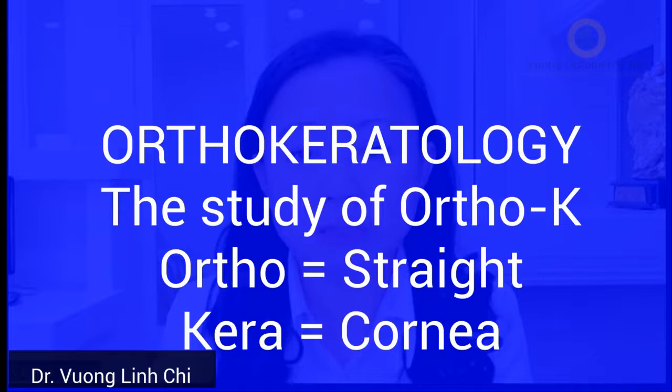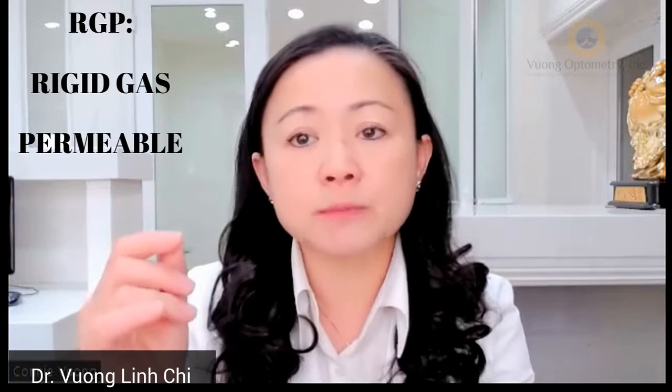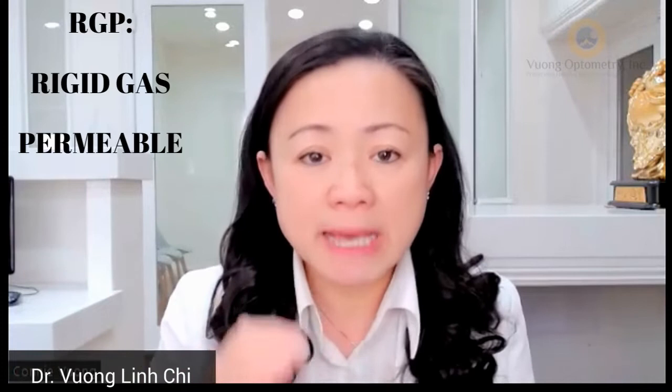Let's talk about what is ortho-K. The word 'ortho' stands for being straight — keeping something straight. 'K' stands for kerato, and ortho-keratology is the study of keeping the cornea straight. Ortho-K is similar to RGP — rigid gas permeable. It's made of a material that allows the eye to breathe. It does not cause the eye to be too dry compared to soft contact lenses. It allows gas to travel between the cornea and the tear layers — that's why it's called rigid gas permeable.